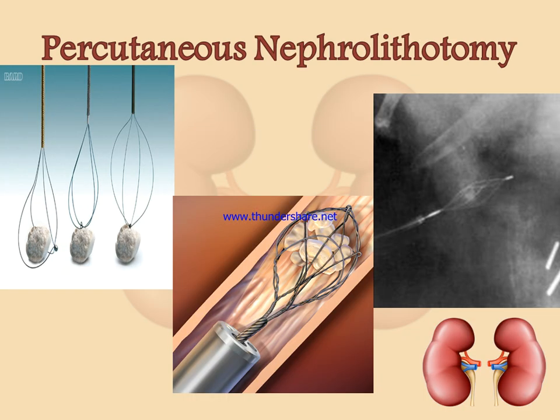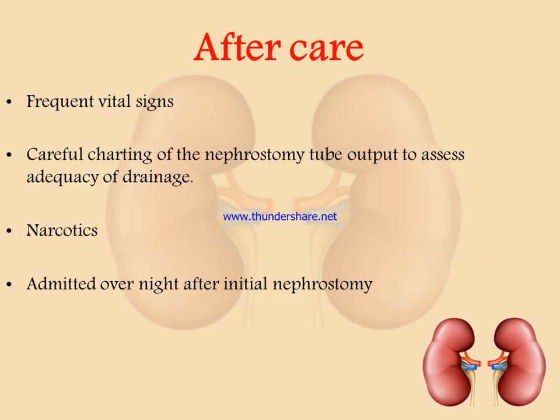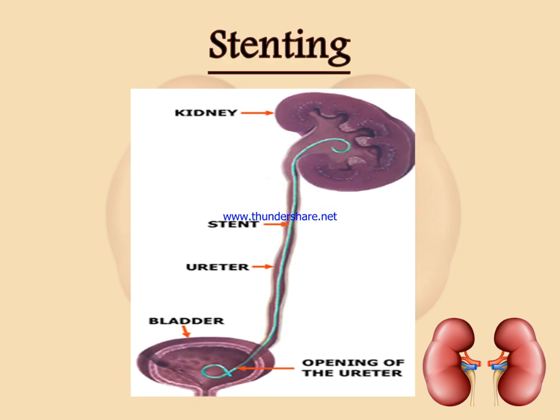This is percutaneous nephrolithotomy. Aftercare: we collect vital signs frequently, we use narcotics, and the patient is admitted overnight in the department after the initial nephrostomy, with careful charting of the nephrostomy tube output to assess the adequacy of the drainage.